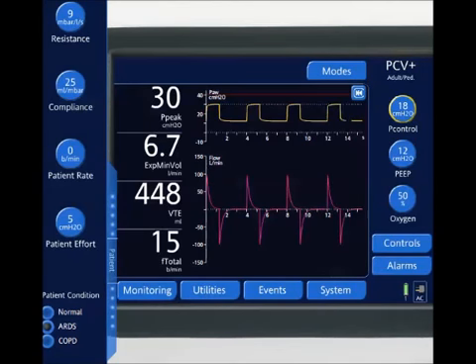Okay, here is my ventilator simulator of pressure control, and we're going to demonstrate what happens when the patient's inspiratory drive increases or there's a change in metabolic demand. You most likely will see these in patients that have ARDS, and the ARDS is secondary to a sepsis, which usually creates a metabolic acidosis, and they have a higher minute ventilation demand. So as you notice, I'm in pressure control ventilation. I'm currently in a pressure control of 18 and a high PEEP.